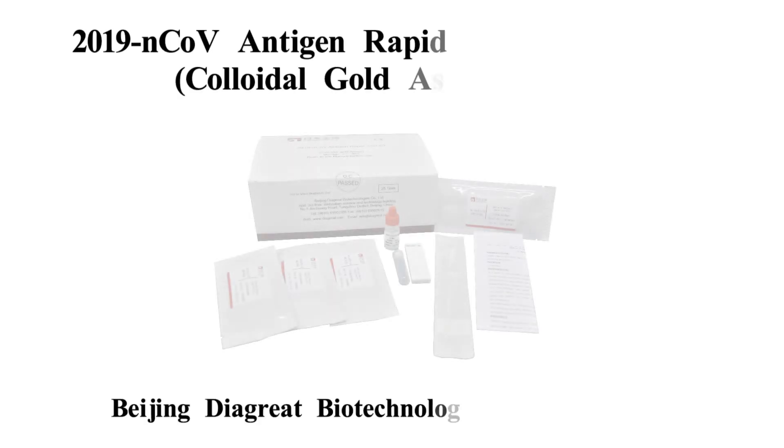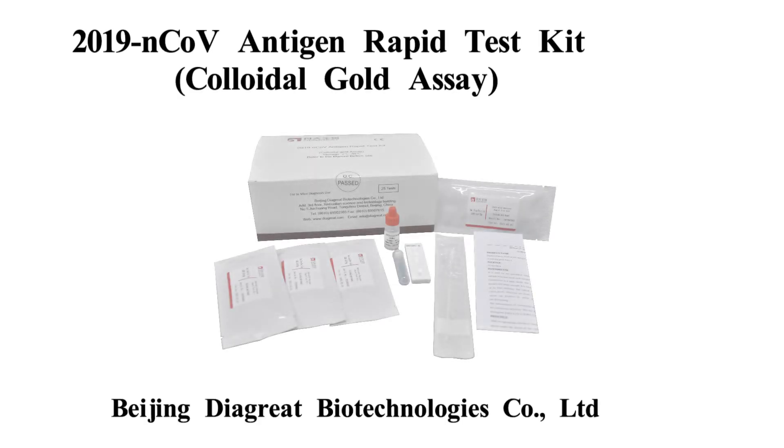Welcome to watch DIGRED 2019 NCOV antigen rapid test kit operation video. Through this video, you will learn how to use the rapid test kit. For more information, please check the manual.